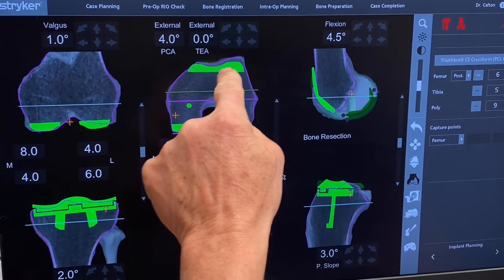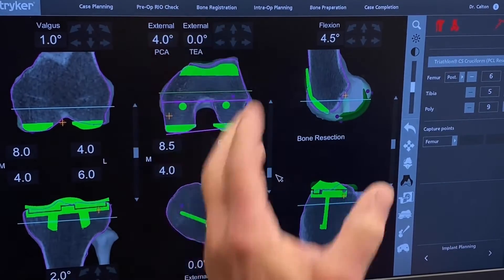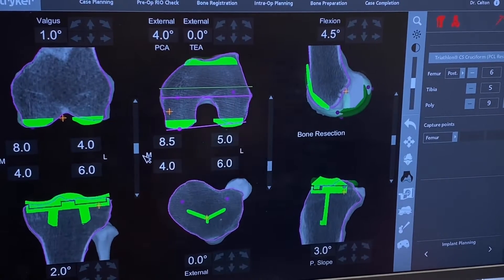That also lets us look at where the kneecap lifts. You don't want to over-stuff that — you don't want the implant too tall, otherwise that puts pressure on the kneecap. So that checks out good. This patient has a little bit of a bow leg, or a varus deformity, to his knee.